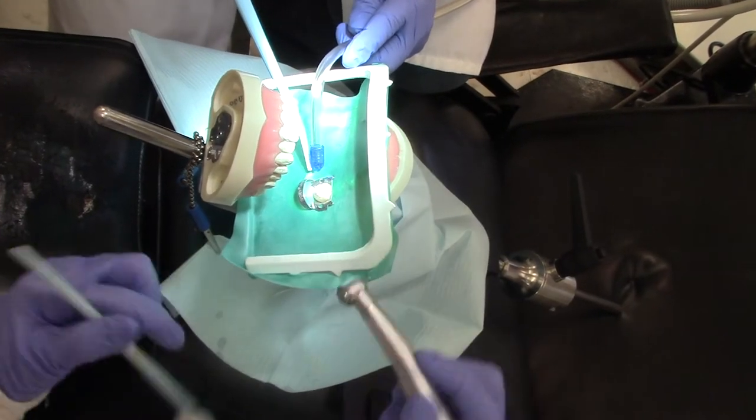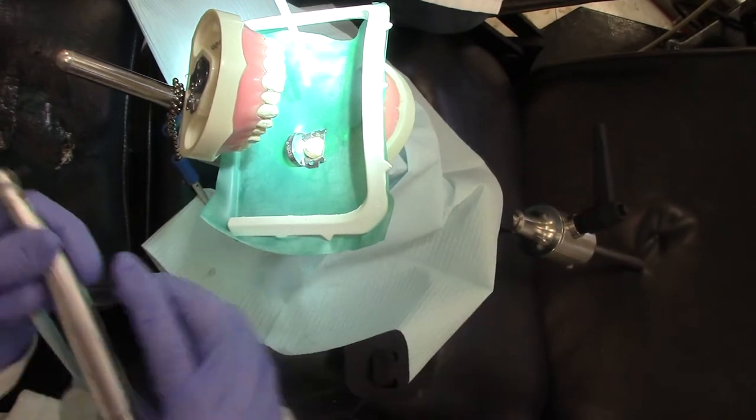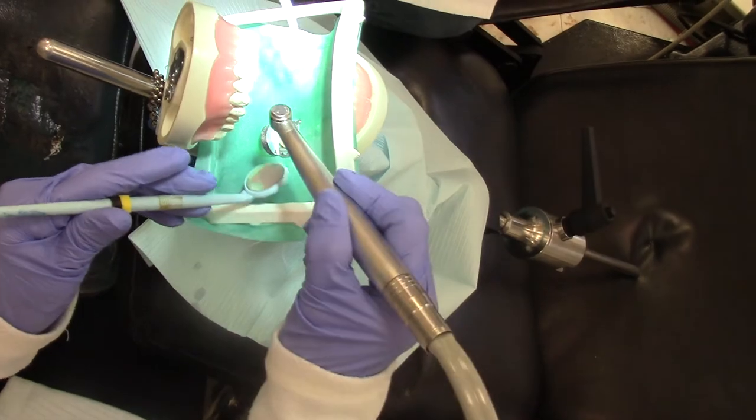We've already done anesthetic on our patient and placed our rubber dam. The next thing we're going to do is our access prep.